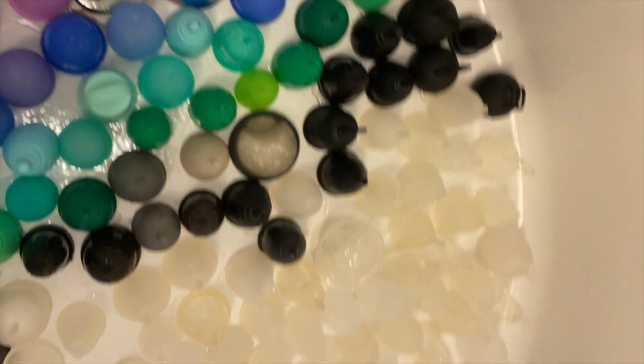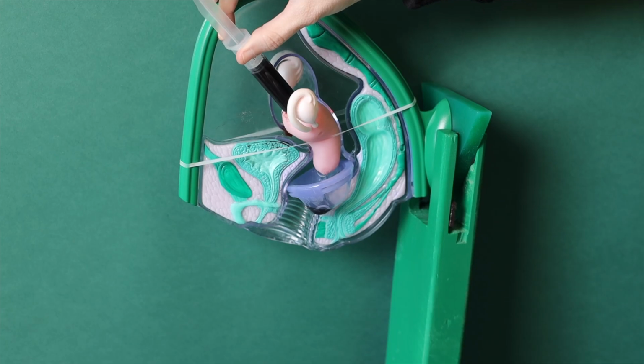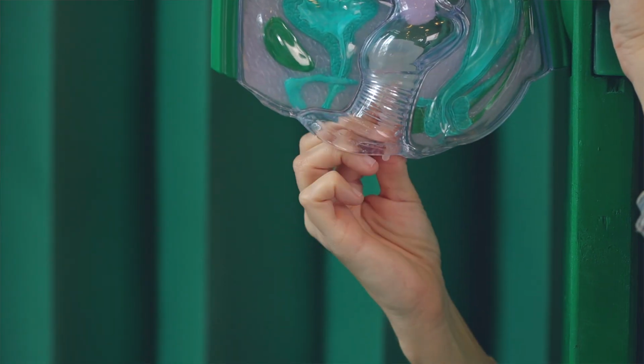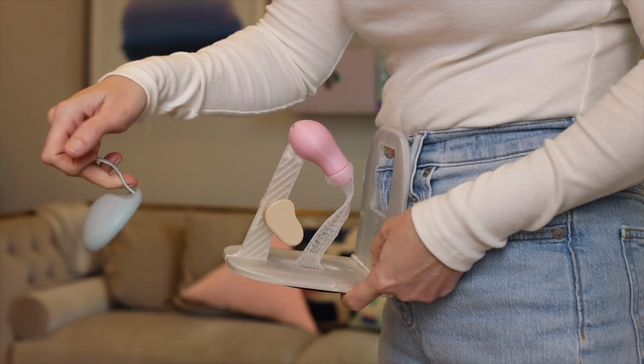But ultimately, you just kind of want to narrow it down. Cup or disc. You're here because you're looking for a similar experience to a tampon, and cups and discs give you that because they're worn internally. Instead of absorbing your period blood, they're going to collect it. And of course, they do it in different shapes, but effectively they're collecting your blood. That's kind of where the similarities end, because how you put them in and how you take them out and that experience is really different, as well as some anatomy differences that mean some people might be better suited to a cup over a disc or vice versa.